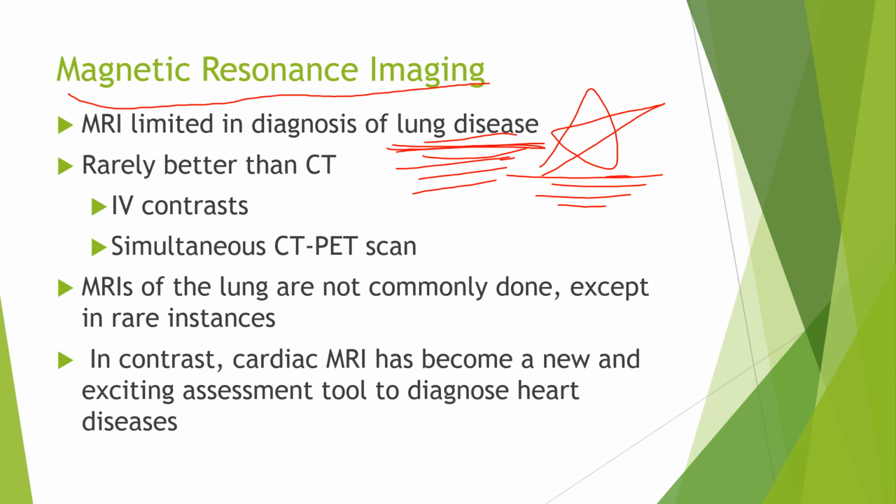For diagnosis of lung disease, MRI is not the best as of currently, as of recording this. It's rarely better than CT scan. You can do IV contrast with it.